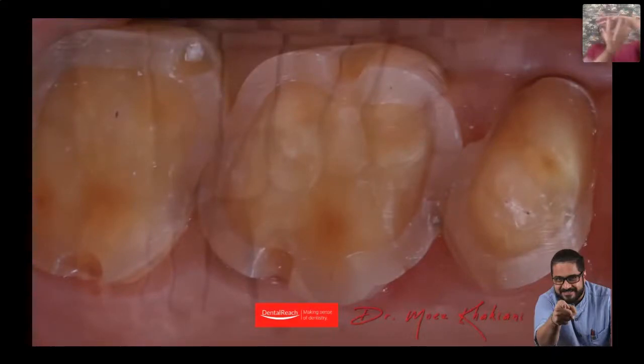So if I have an occlusal overlay, it's like an occlusal veneer, it's going to restore function whilst being extremely conservative. Why will this tooth need endo? No need for endo. And because there is this white ring of enamel present all around, I will get fantastic bond strength. Remember, laminates don't debond as long as there is enamel.